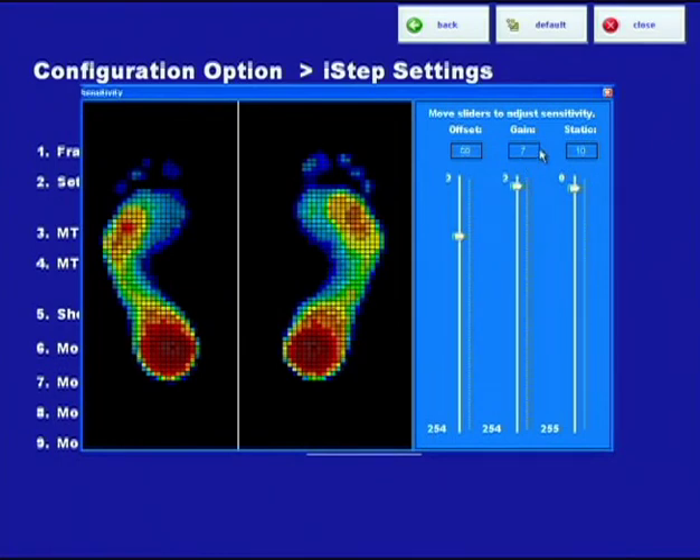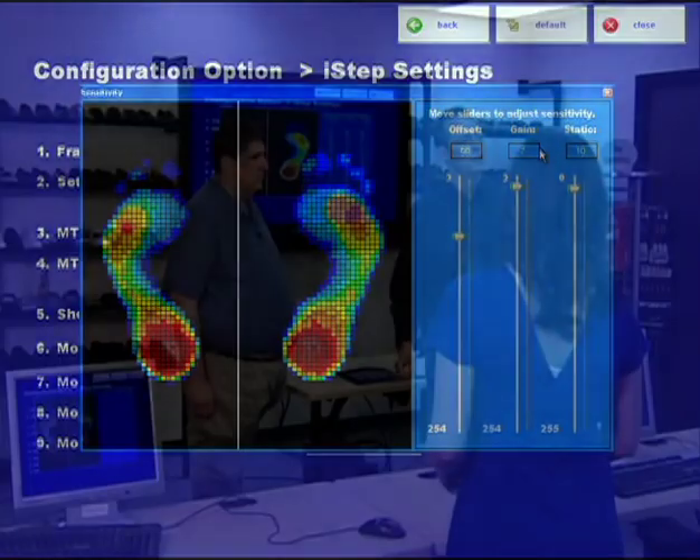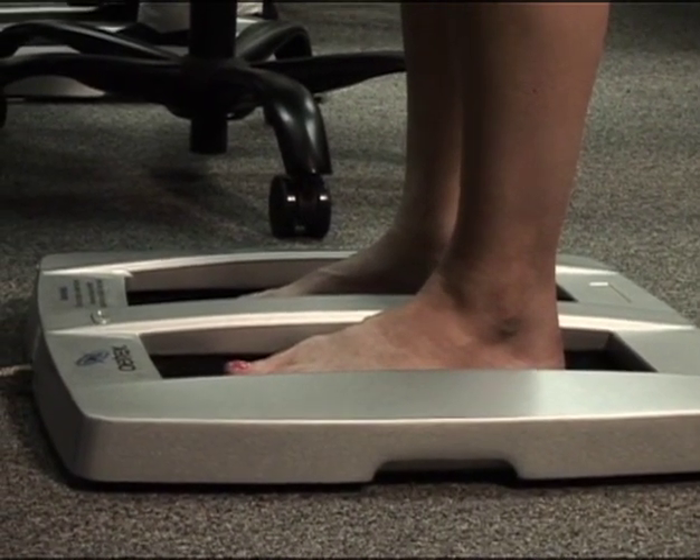The last one is static reduction — what it really is. We want to eliminate static from impacting the test. Static reduction we often keep very low, but you typically don't want it at zero. Because when it's zero, you'll pick up even a speck of dust that might be on the conductive mat. When we first launched the I-STEP years ago, we didn't have this feature built in. We were finding random pressure sensors were popping up — it could be just little dust in the conductive mat or a piece of clothing hanging over. So we built in a feature called static reducer.